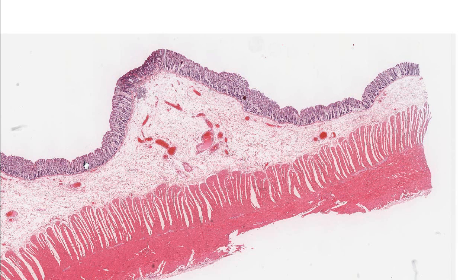This is a resection of colon. Similar to all the locations in the GI tract, we have four layers. We have our mucosa up here, which is bounded by muscularis mucosa. We have our submucosal layer with connective tissue and blood vessels. We have our muscularis propria, composed of an inner and outer smooth muscle layer. And then we have our serosa as the outside layer.